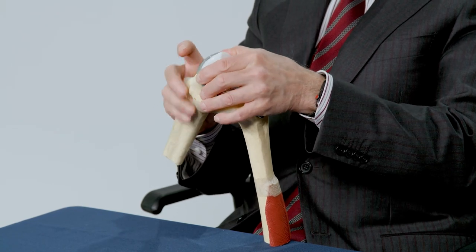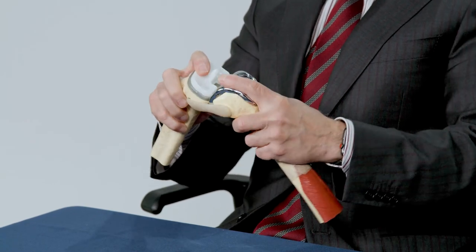If needed, a small piece of plastic is placed on the back of the kneecap, but this is not always needed. The knee replacement pieces are either cemented or placed without cement in the operating room.